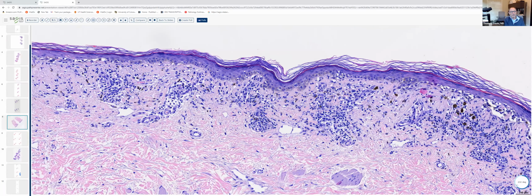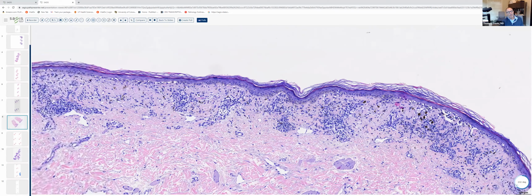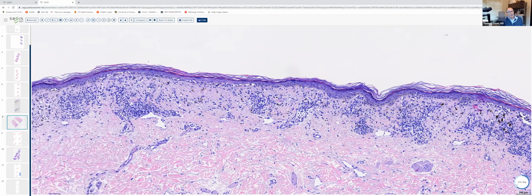which is believed by most people to be a variant of lichen planus, also sometimes going by the name lichen planus pigmentosus. It is a much more subtle expression of lichen planus than garden variety lichen planus, and lacks the epidermal hyperplasia, hypergranulosis, and compact orthokeratosis, and the inflammatory infiltrate is usually much less robust. This is actually a pretty active inflammatory EDP. In late lesions of EDP, sometimes all you'll see is subtle vacuolar change and melanophages within the papillary dermis. So this is a condition where clinical pathologic correlation can be quite helpful.